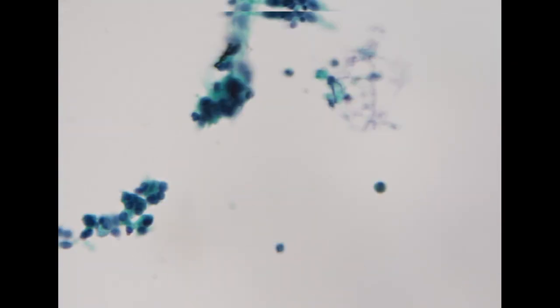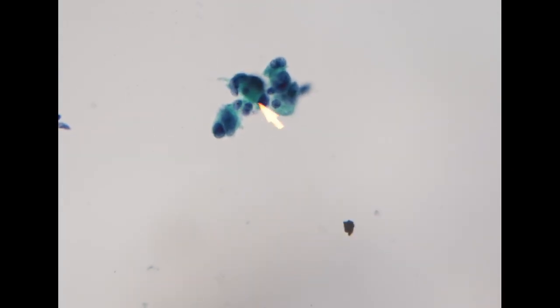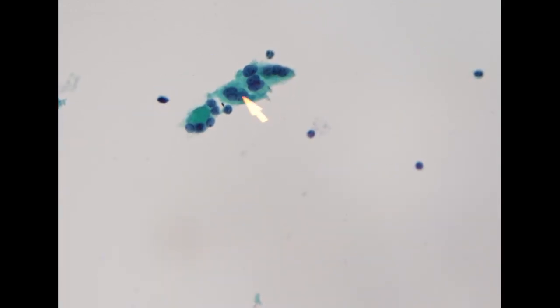So I had a discussion with Dr. Luis about the case, because in this particular case we do see significant nuclear atypia, in addition to a very prominent microfollicular pattern. Here we also see some dense colloid.